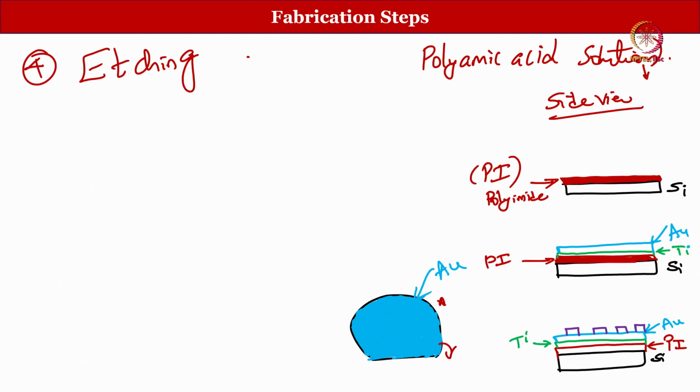Because when you expose, some of the photoresist gets exposed to the light and becomes chemically modified, right. That chemical nature will be modified and it may become soluble or it may become insoluble, right. So, let us assume that wherever the pattern we want to form becomes insoluble, the remaining areas become soluble and then we etched it, right, by using photoresist developer.